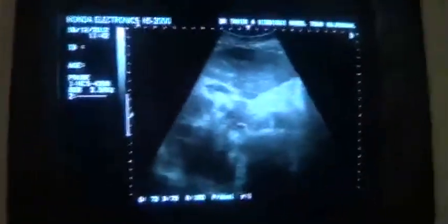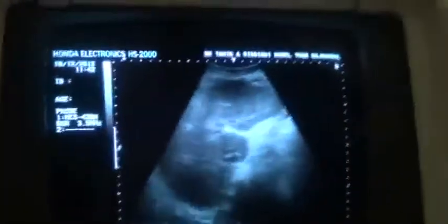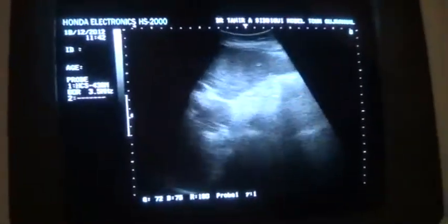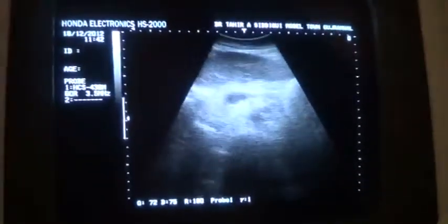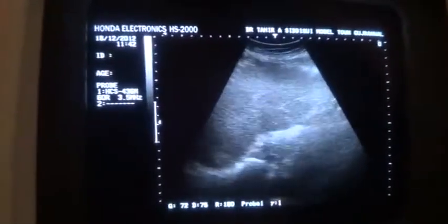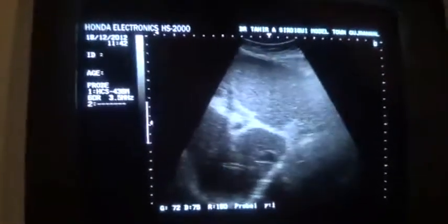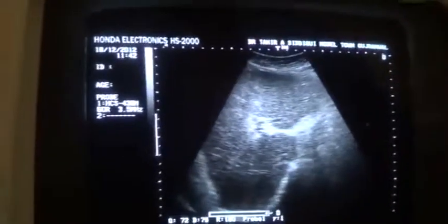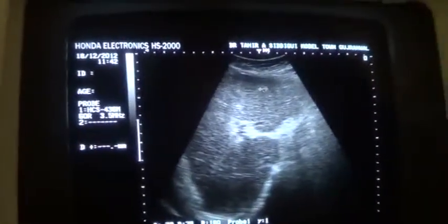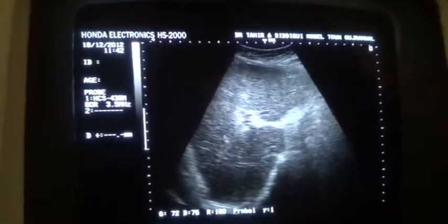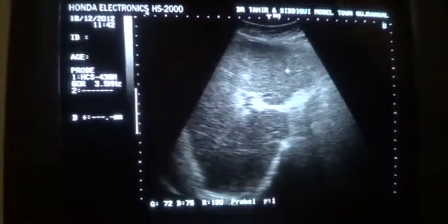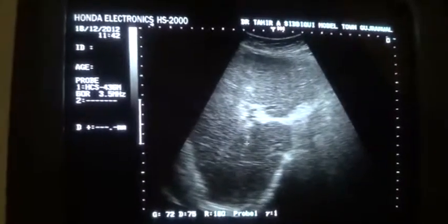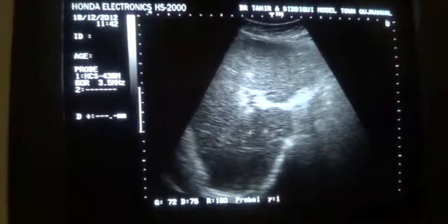This is a transverse section of the liver, the left lobe, regarding the parenchyma study. Now you see that the liver shows increased parenchymal echogenicity with coarseness all over. Coarse texture is seen.